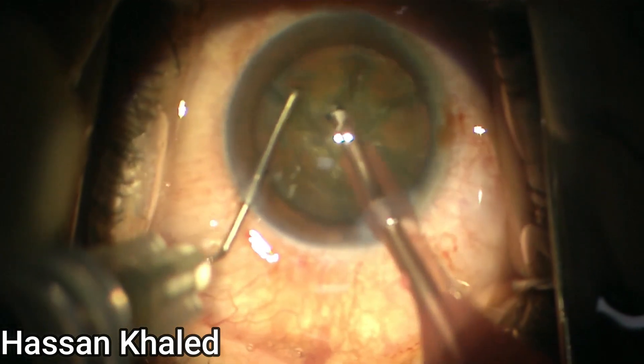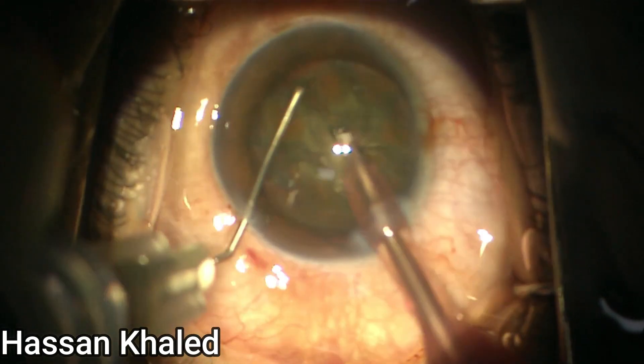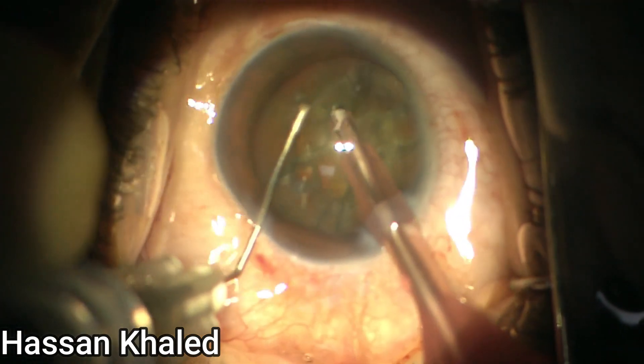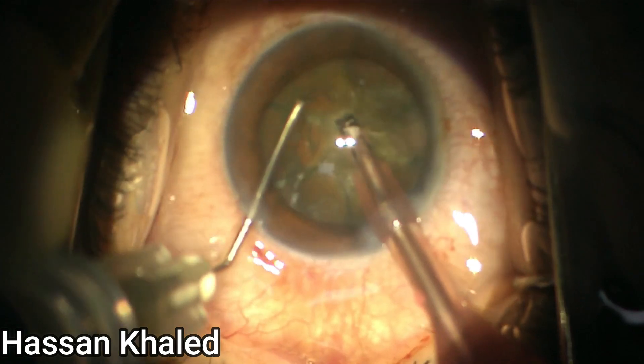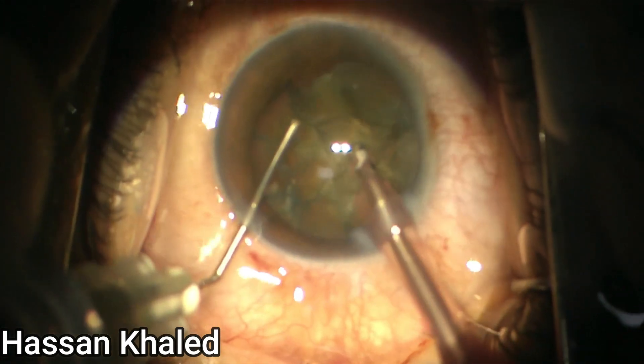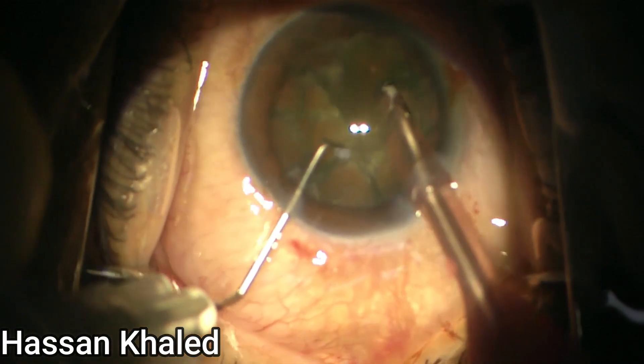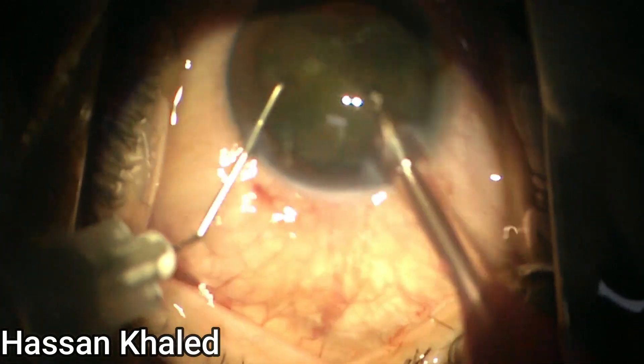You can see this technique is repeated more and more. You can see the nucleus has been chopped into smaller pieces. Here is the second half of the nucleus — you can see there are many small pieces of the chopped nucleus.